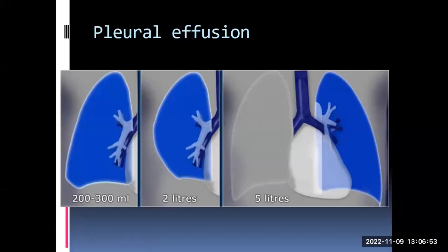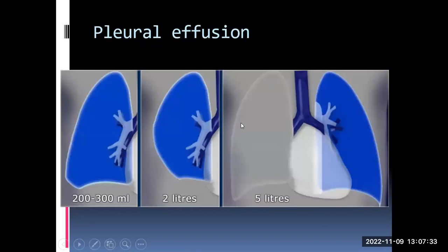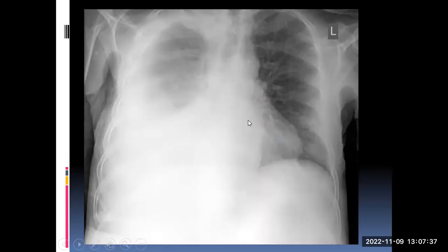Talking about abnormal fluid: it is usually filled in the pleural space. Just know that if you see this much fluid on a chest X-ray the patient could have 200–300 millilitres in the pleural space. If it reaches halfway up the thorax, it is about 2 litres. A full opacification would mean around 5 litres. Pleural effusions always have an upward meniscus — a crescent shape — if it is a pure and simple pleural effusion. If a patient has a sizable pleural effusion, by the laws of Archimedes something has to be pushed, and the mediastinum is the most mobile structure.